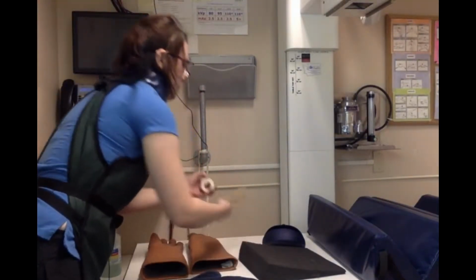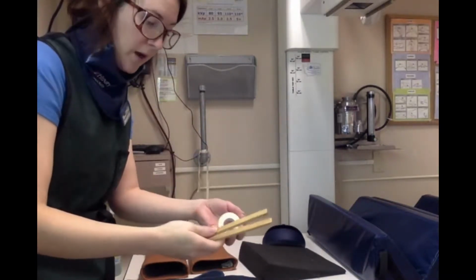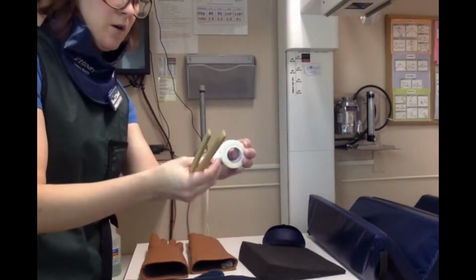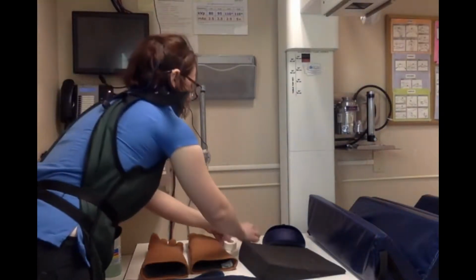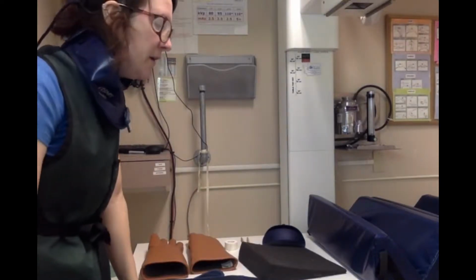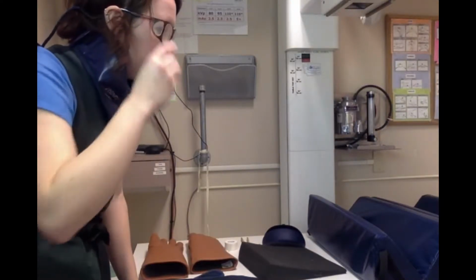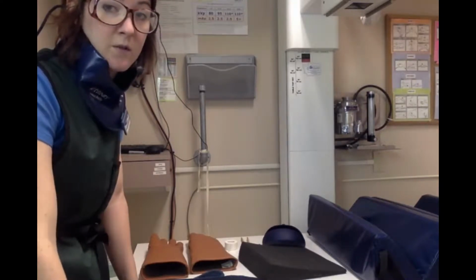If I needed to position a patient's limbs or hold its tail out of the way or anything like that, we have these helpful little tongs we can use to kind of pull on a limb, or we can use tape. We could also use surgical ties. Here at my hospital, we do our best not to use sedation if possible. If we need to radiograph a patient that's already under sedation, then great. But sometimes when pets are really painful, oftentimes the doctors don't want to compromise other body systems or their health by sedating them.